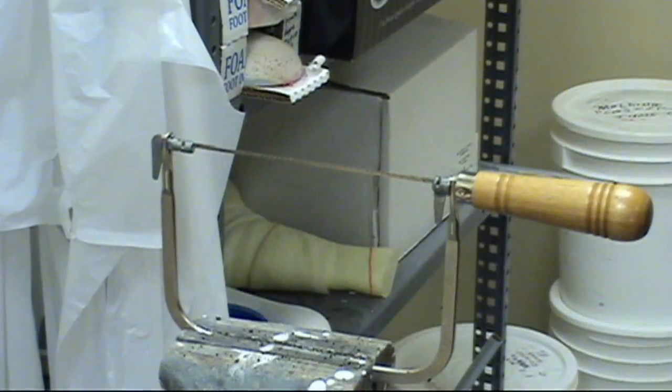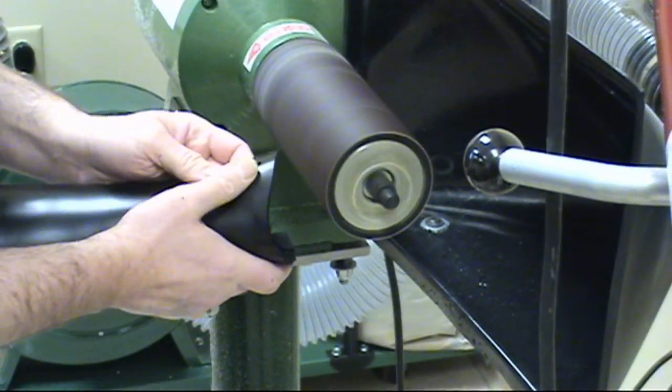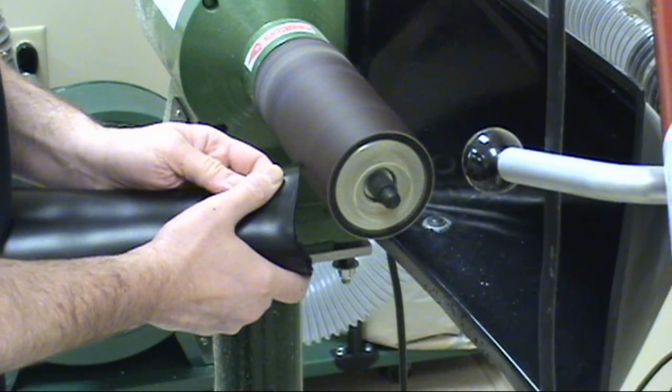Cut the orthosis along the lines you etched in earlier. Clean up the trim lines using a sander, being sure not to sand past the trim lines.